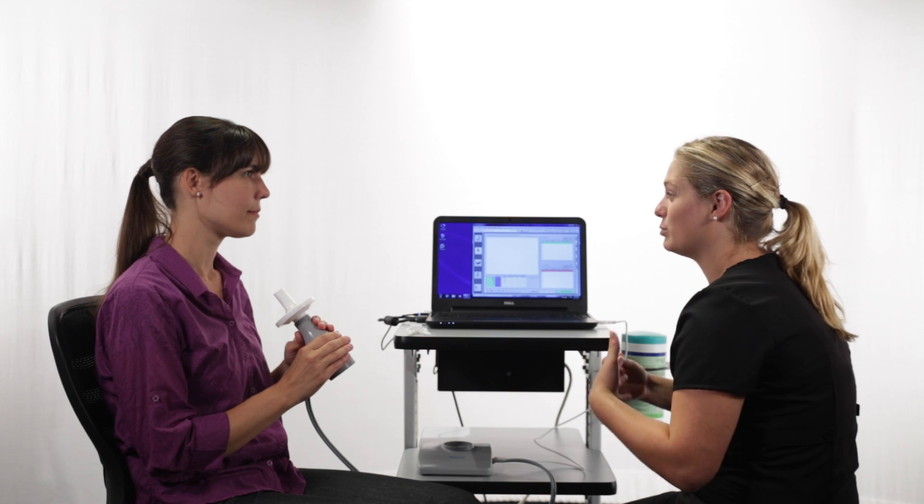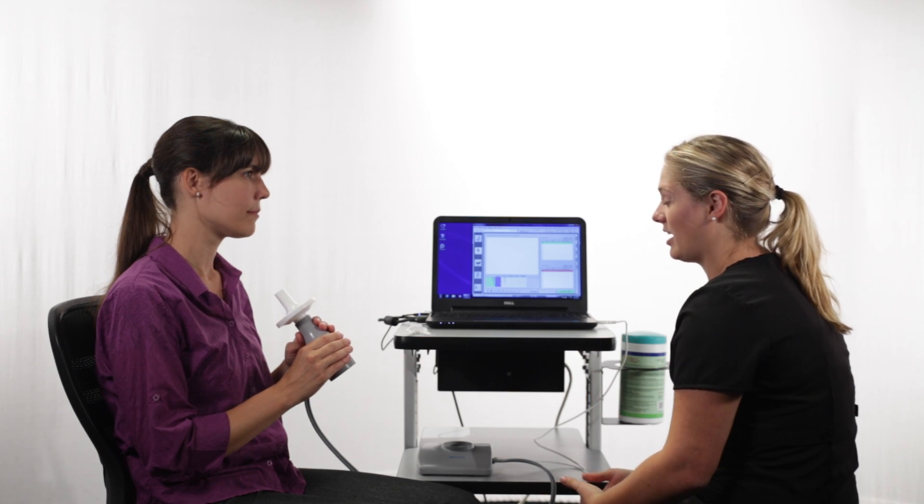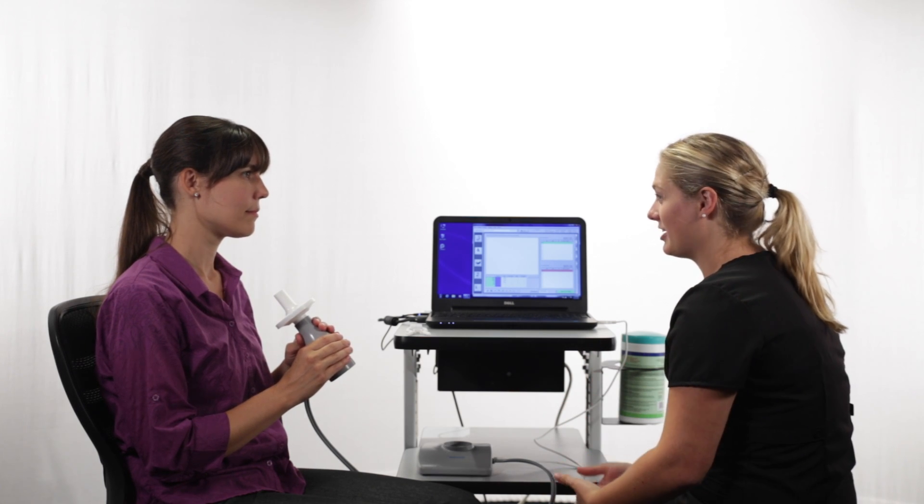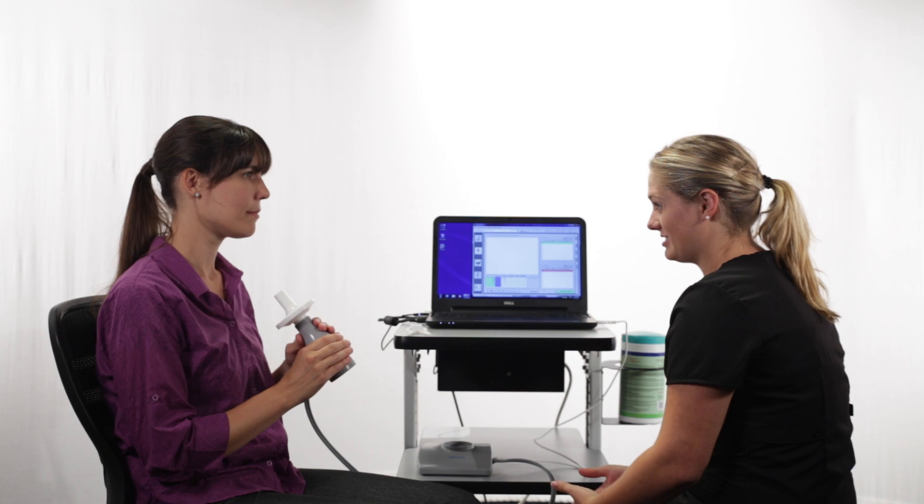Performing SVC on the Pneumotrack. A common mistake when measuring SVC is not establishing FRC where the patient has settled down into steady state breathing before attempting the maneuver.